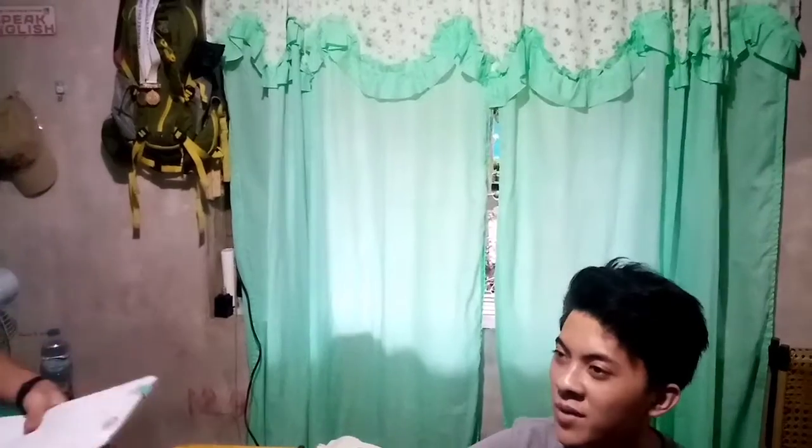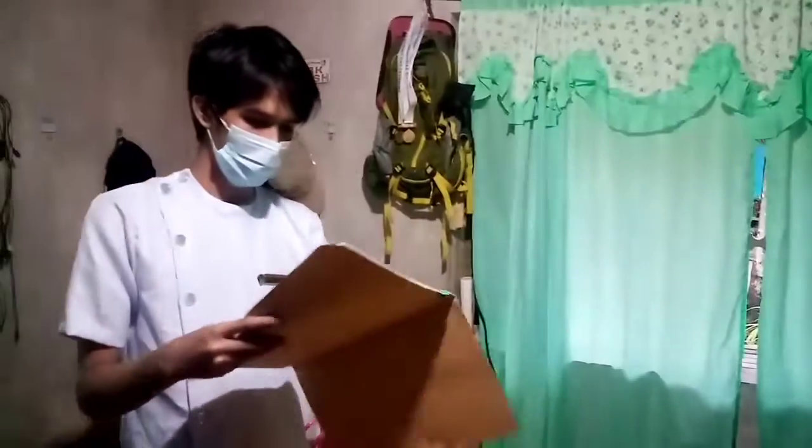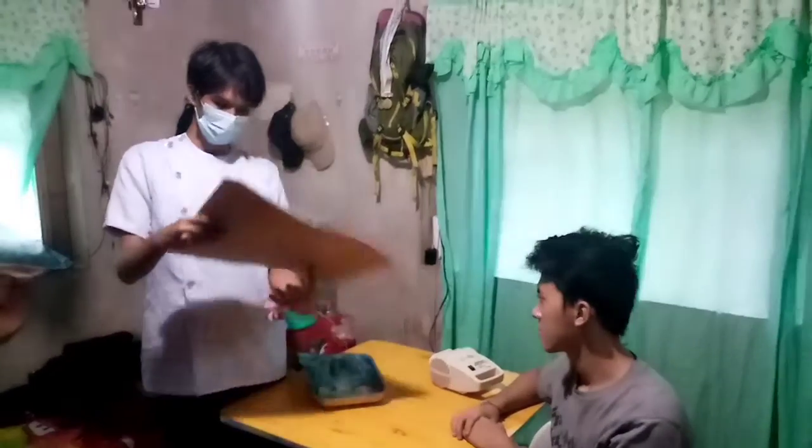Yes, I am. Explain the procedure to the patient. Sir, today we will induce the aerosol medicine.